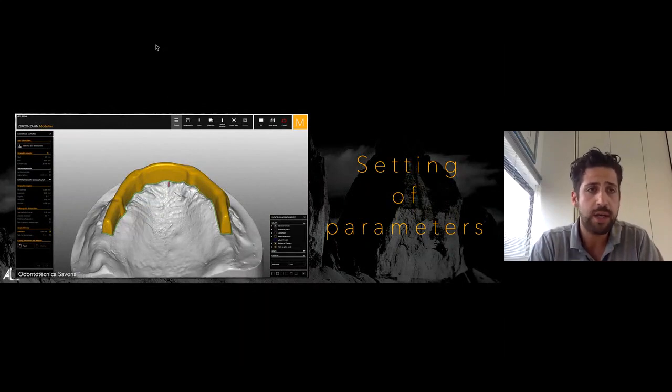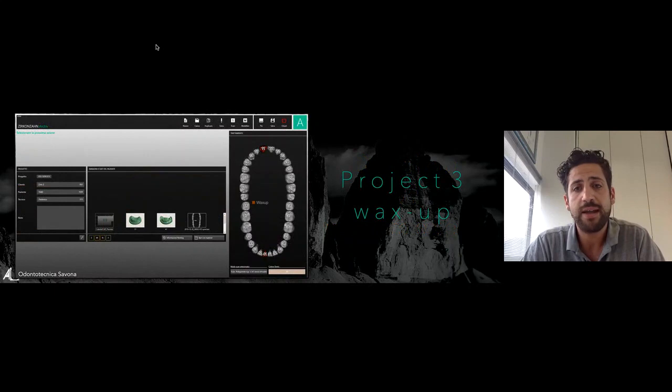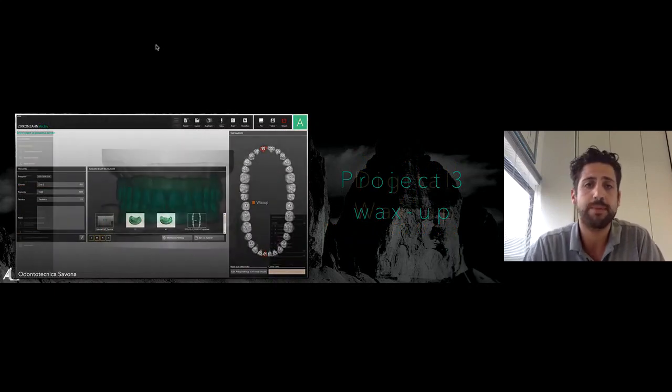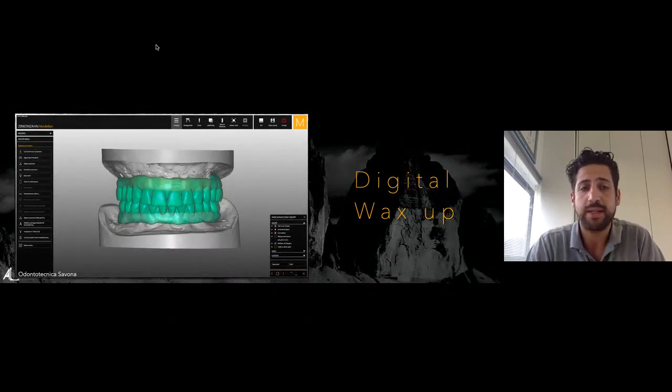Okay, in that way we have the possibility to make a single margin around our bar to make the overconstruction in zirconia. You can see in this step we have the possibility to set the parameters about the cement gap. Usually I like to use 0.07 to get a really good passivity of the zirconia. And after that, we go to make the project in 3D. Okay, we adapt the digital wax-up, and this is the same file of the prototype.